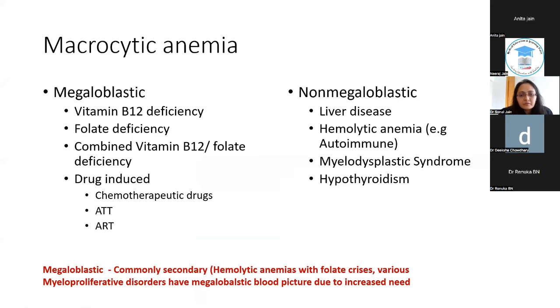This is important because I've burnt my fingers many a time. The standard, very classical megaloblastic anemia, which is showing macrocytes, ovalocytes, NRBCs, Cabot rings, basophilic stippling, everything, and you write it megaloblastic, and what it turns out to be. And it's important to remember this.